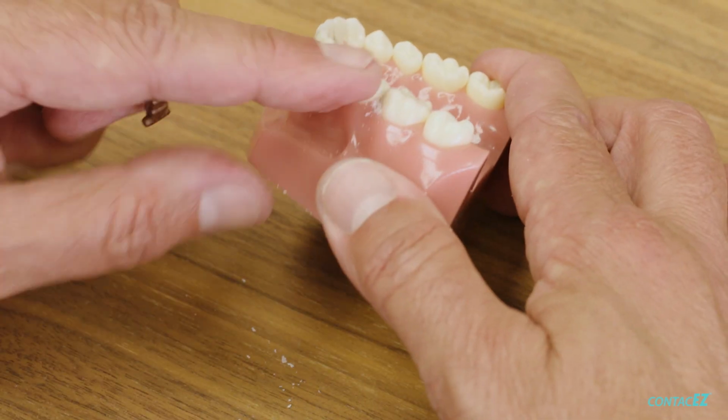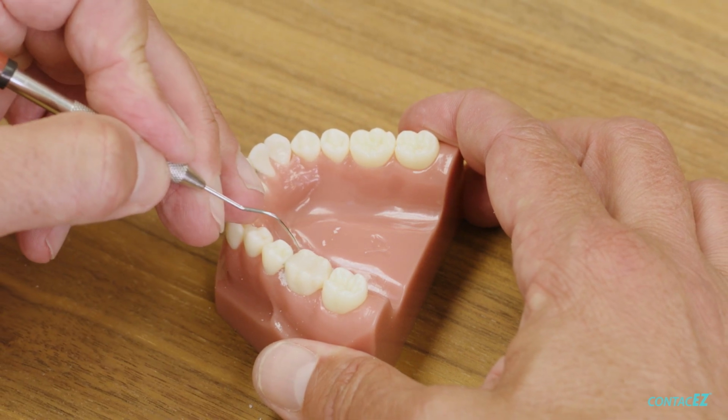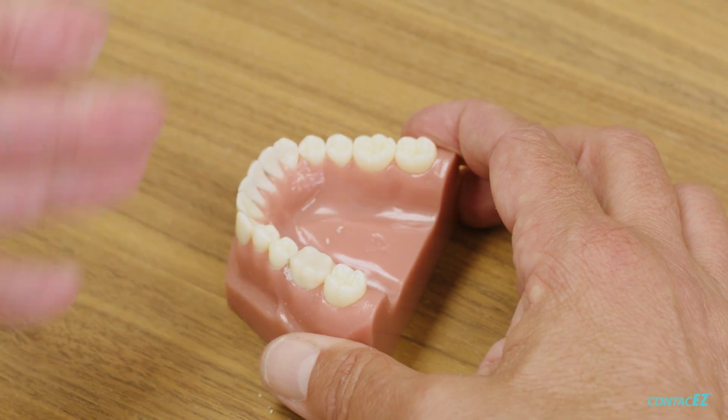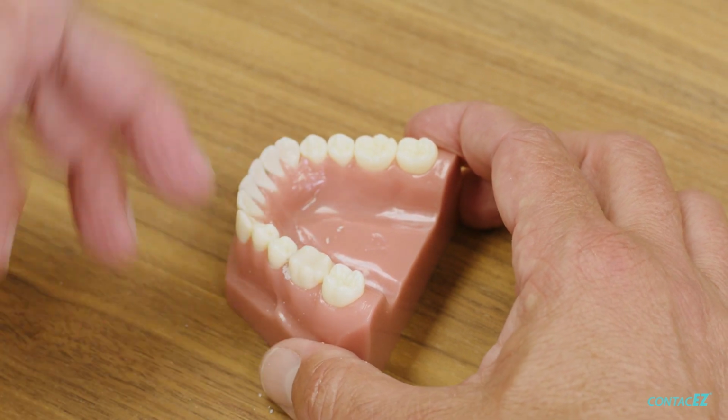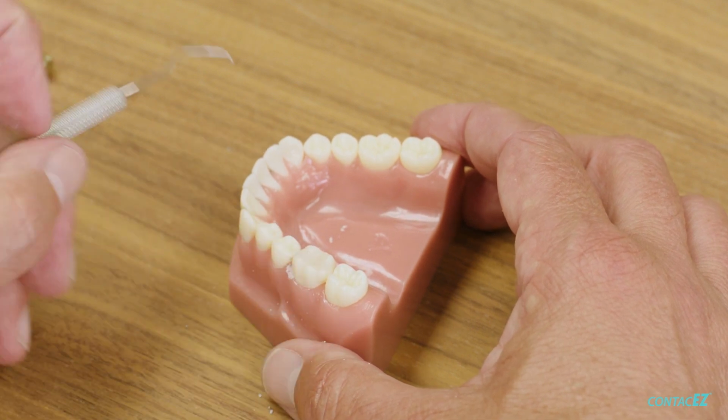So once we've gone in there and polished it, we can go in again with the Explorer and verify that we've been able to remove that ledge that was there. I used to do this in the old days, trying to use a rotary system or a reciprocal system, and I always felt very nervous about going subgingival and cutting underneath it.